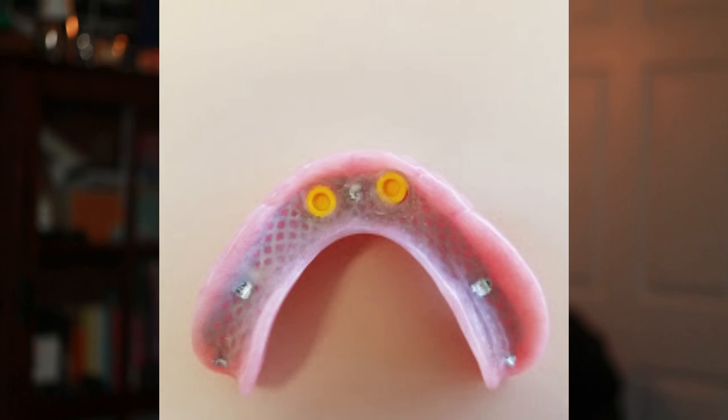Now that his jaws have healed, I started making him a set of final overdentures. The immediate dentures still work, but since his jaws have shrunk a bit when they healed, the dentures don't fit as well anymore. He mentions that he gets food stuck underneath them.